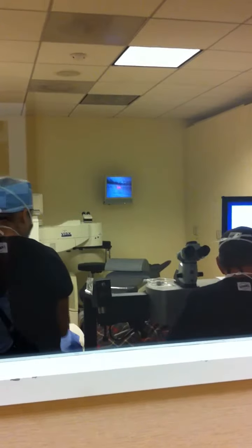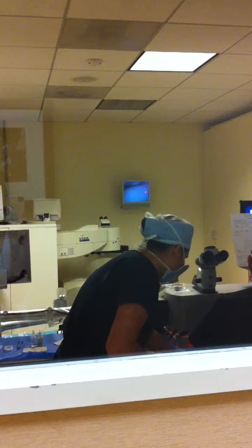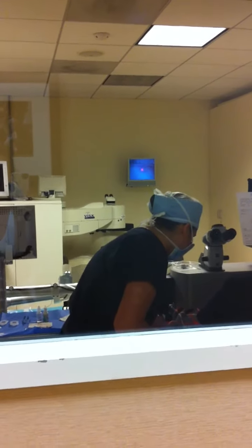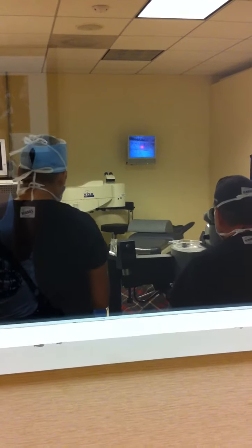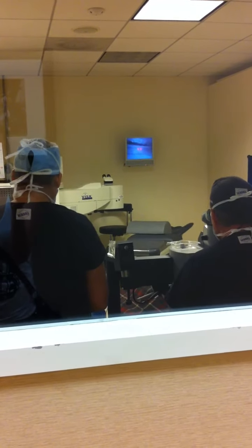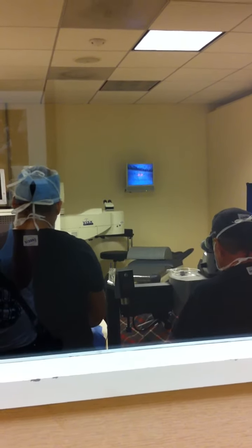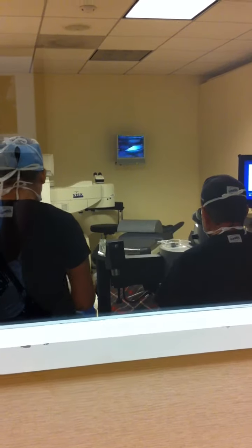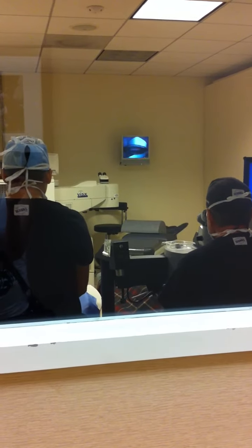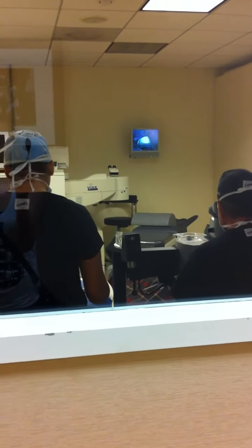All right, this is getting less interesting now. The eyes I thought closed. It was way more intense than it actually is. Yeah, it's not that intense. It's kind of cool because the eye gives way a little bit. I'm not doing more slicing and dicing. That'd be like peeling an orange. But it's not. You're saying when you take the outer layer off, I was thinking you just get the knife and pull it back across. No, it's not really like that. You scrape it off.